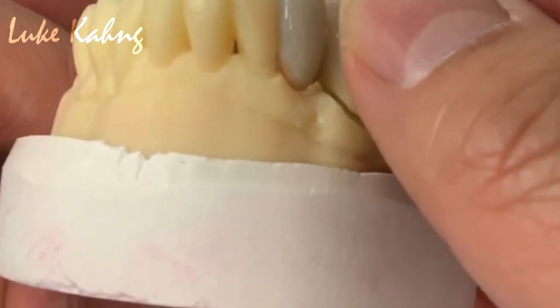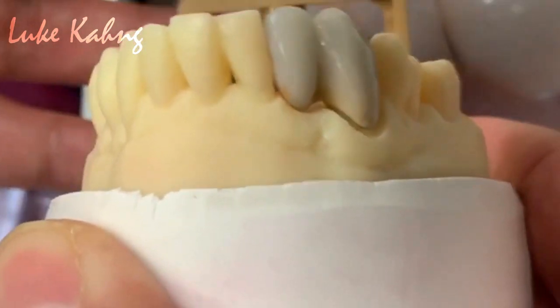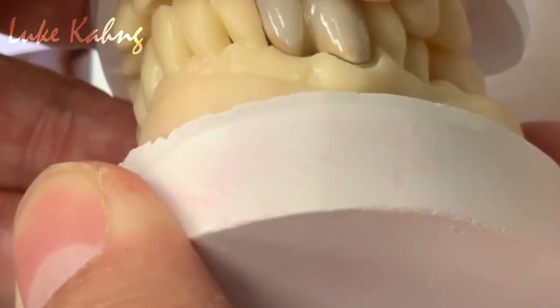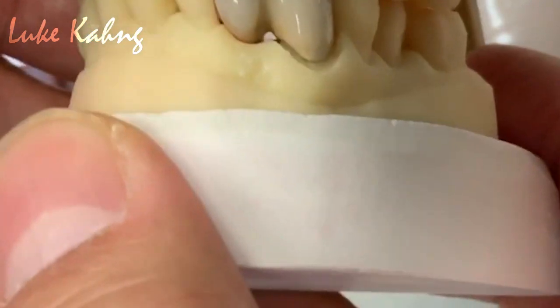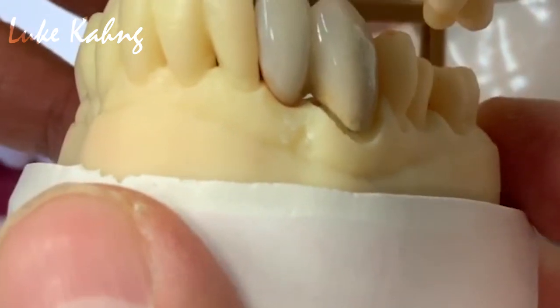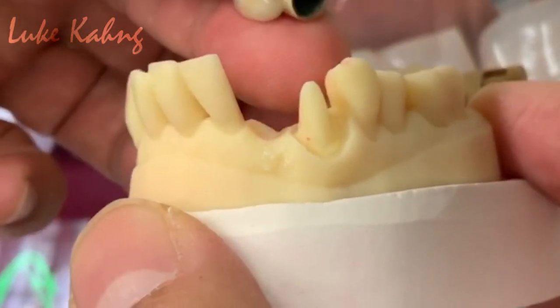Sorry, this is good. Now, I get the occlusion just slightly. Yep, and let's move on to canine rise 2. So, this is a great 2-unit porcelain fused. Old school.